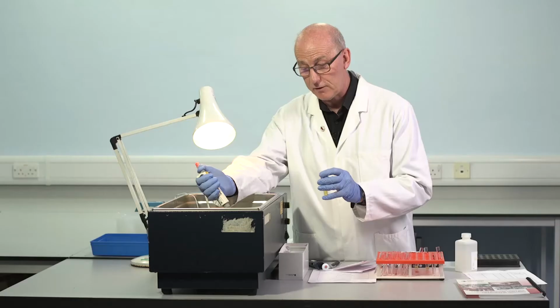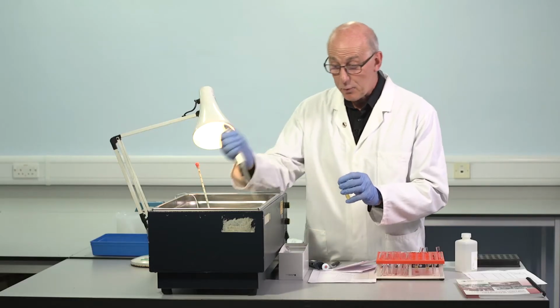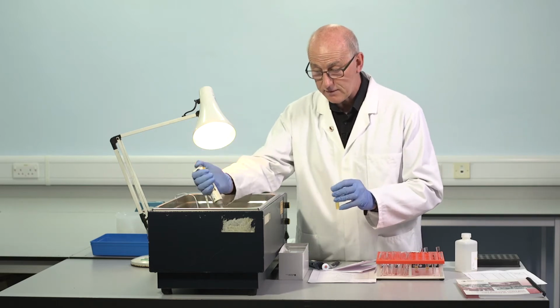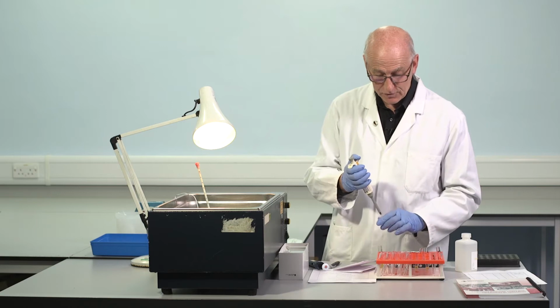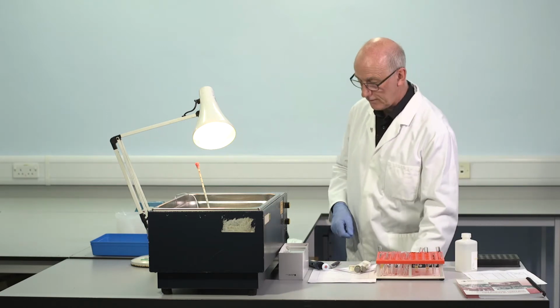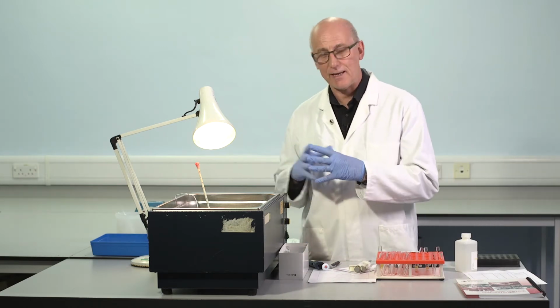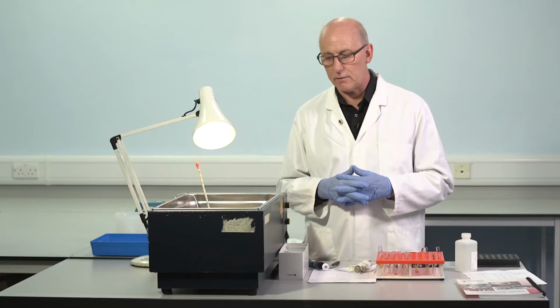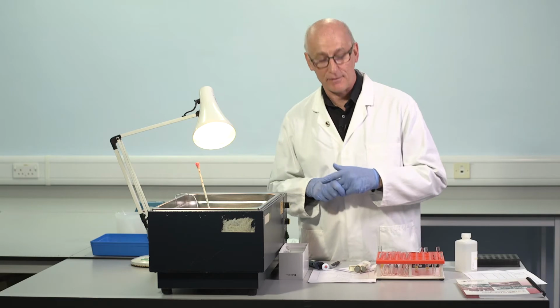warming up to 37 degrees. It's important to check the temperature on the water bath. We should record this at each time of use. We want to be sure that the water bath is retaining its temperature. You can see we have a thermometer, and so this is checked and recorded on a daily basis and at the time of the testing.